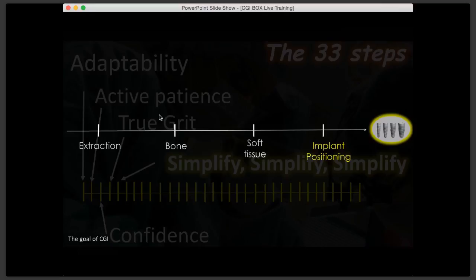She came in, not a new patient. She's been in our practice for a long time, but one day she came in and said, you know what, lower right-hand side hurts. I have lots of pain. I can't chew. Something's wrong. Okay, first thing we do, we take a radiograph. Maybe something is going on in the furcation area, but all in all, the bone looks pretty good.